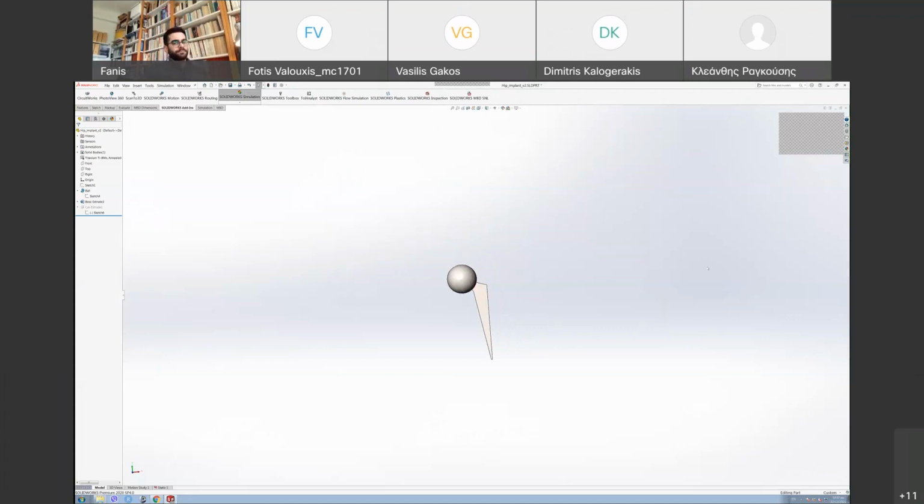Okay, so this is the 3D model we're going to create. Obviously, it's a pretty simplistic model. There's not much to it, but it's a good starting point to start studying and see what trends we have with this particular implant. If you have any questions regarding the design, I will design it now for you and we'll see the finite element analysis and all these things. Just interrupt me, ask me whatever you want, okay?